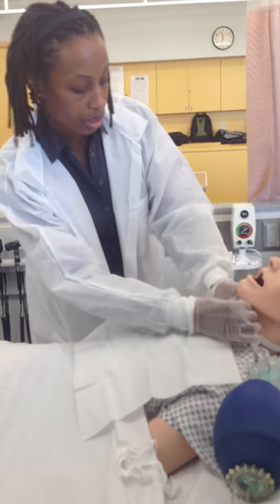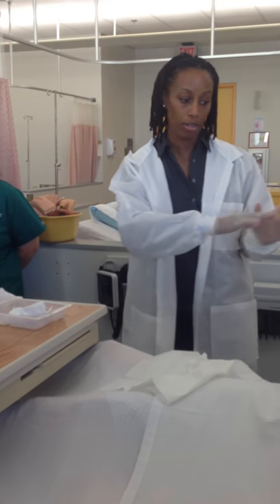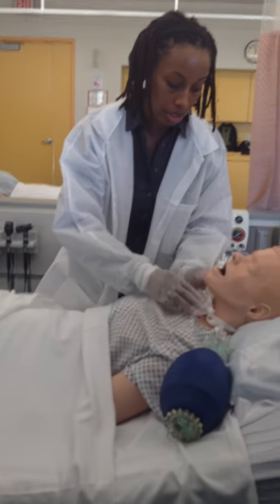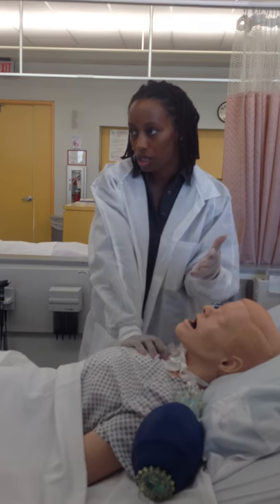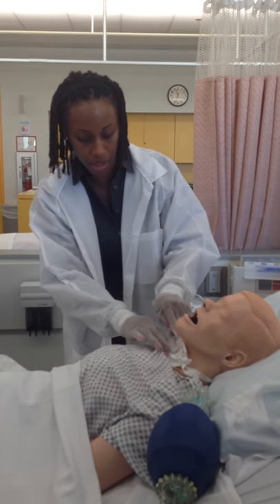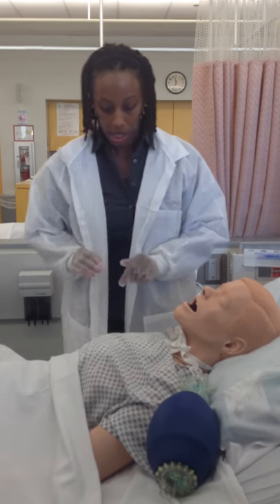And that's it — ask your patient how they're doing; everything is done. The sterile part is the suctioning; after that it's more of a clean technique, but you do everything all in one. You want to do the suction first and then do your cleaning. The trachs will be sutured down, but it depends on how well the surgeon does it and whether the trach is long-term or temporary — you may see little black knots connected to the trach in the patient's skin. Any questions about that? You can do this procedure for next week, or you would do the Foley catheter.